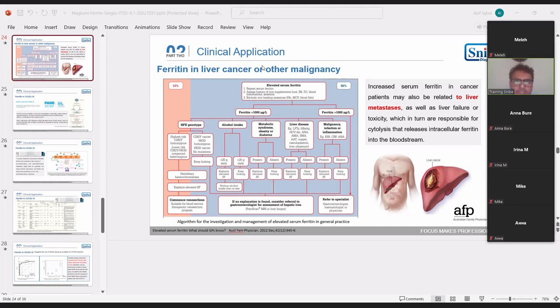How long does the reagent last after its expiration date in your experience? Okay, very interesting question. I really appreciate that question. Usually the average onboard stability according to the package insert is 4 weeks, right?